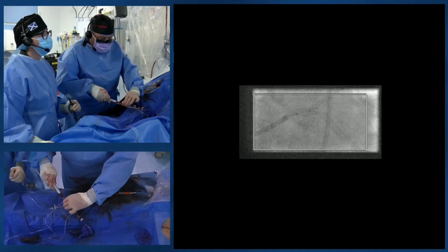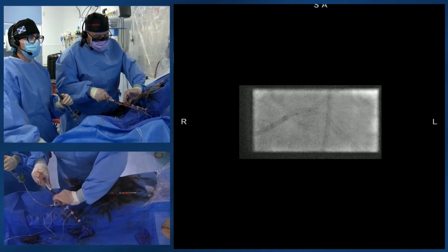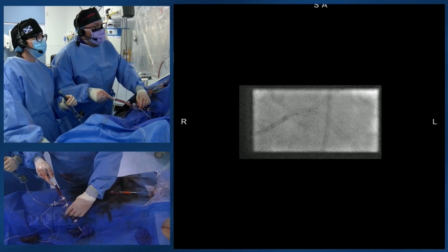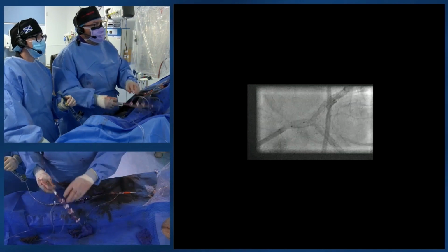Check our situation. So StentViz vessel viz involves administering contrast as well as doing an acquisition for a StentViz. So we're all set up for that now. We'll do our acquisition, and the software actually tells us when to inject contrast. So I've injected the contrast now.